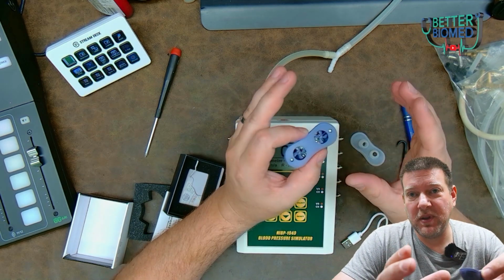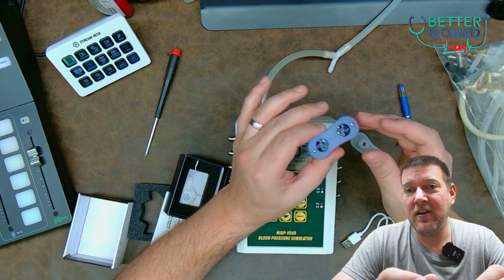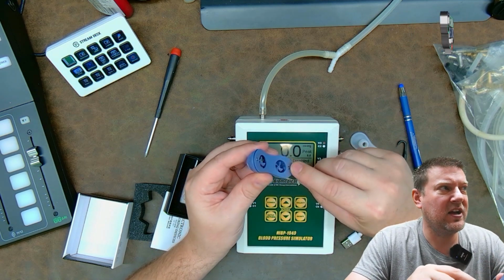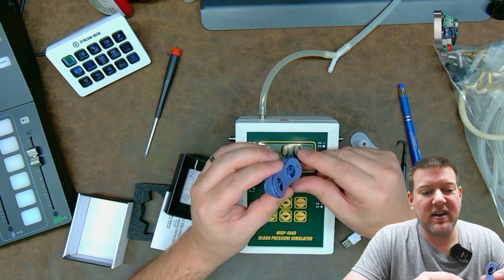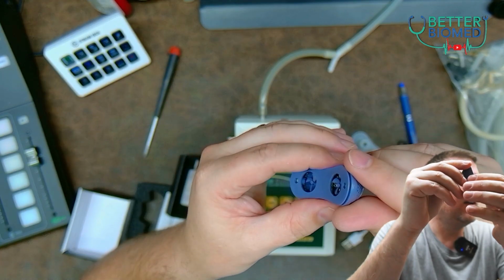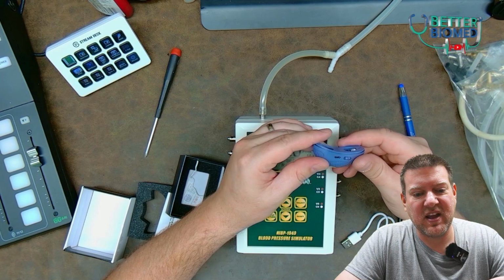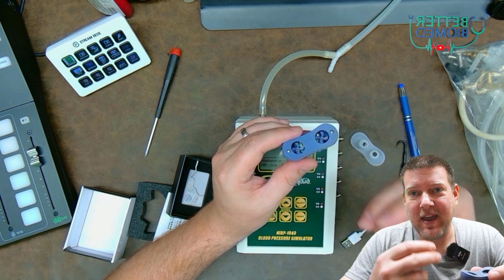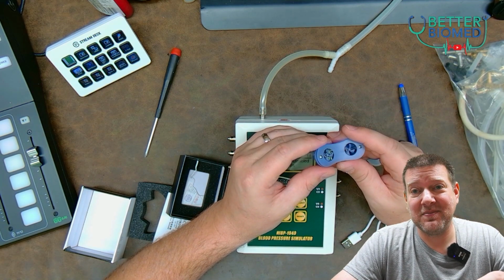The larger the blades and the closer they are, imagine a jet engine. On those compressor fans, the blades are kind of closer together and they seal really closely to the edge of their housing. So this fan right here, look, you've got wide open areas off to the side. Those fans are not even close to creating a seal, so they're not going to develop any sort of static pressure whatsoever. This thing here does have a little bit of vibration, and I don't know about you, but having something that vibrates inside my nose would drive me absolutely crazy.